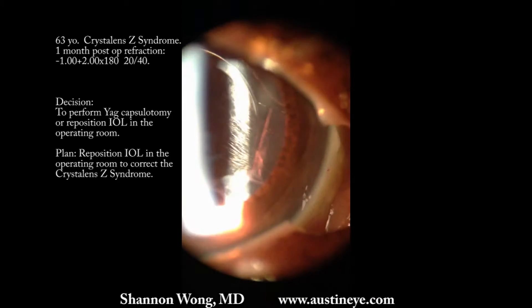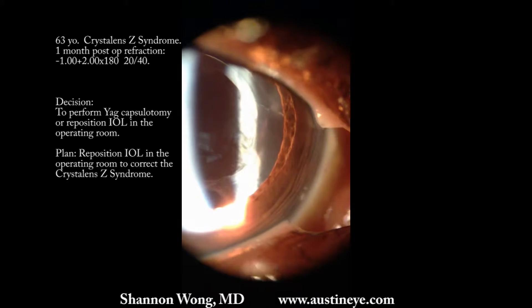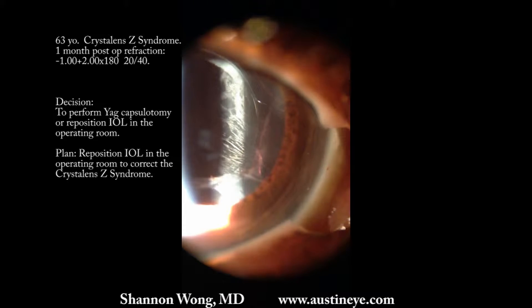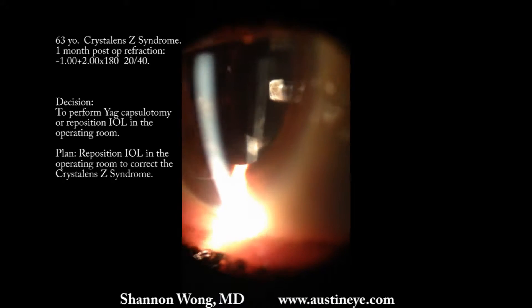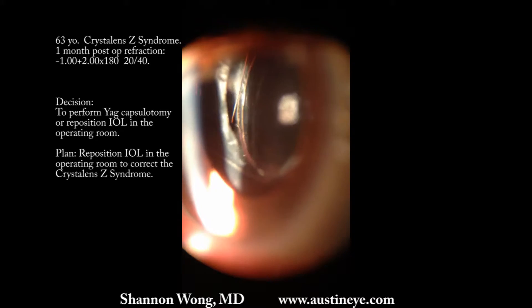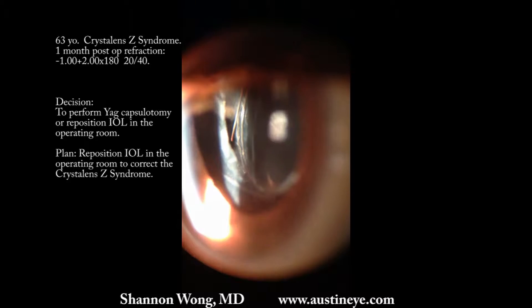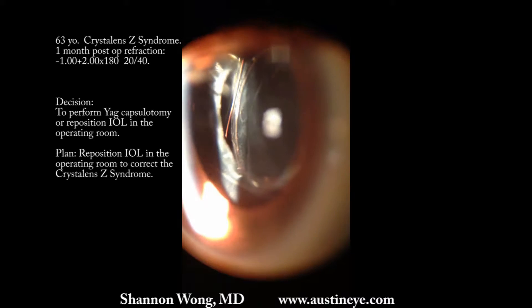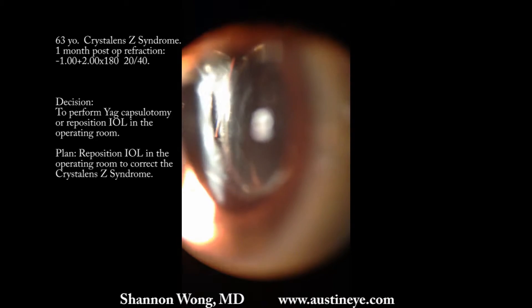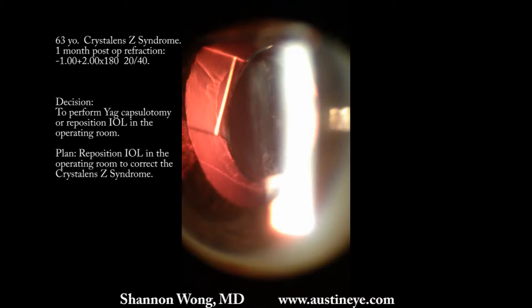The patient is about one month post-op after receiving a Crystalline AO. You can see in these slit lamp images the tilt of the lens, where the left side of the lens is bowed posteriorly and the right side of the lens is vaulted anteriorly.